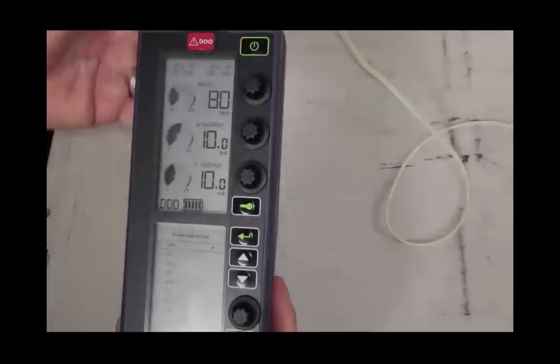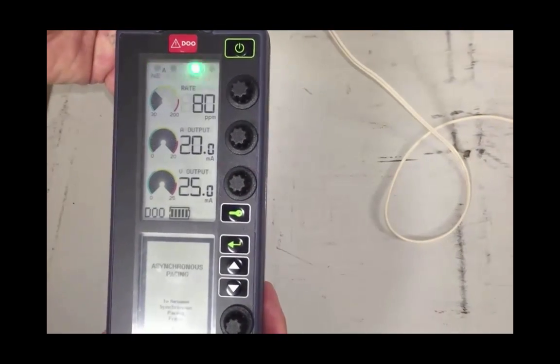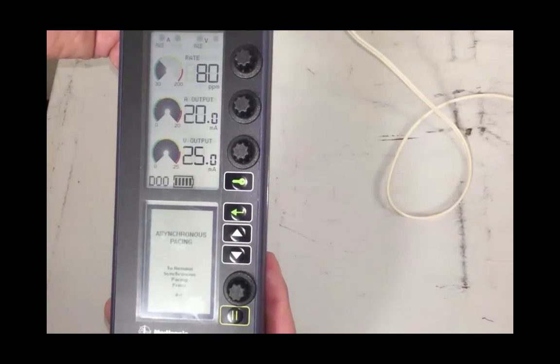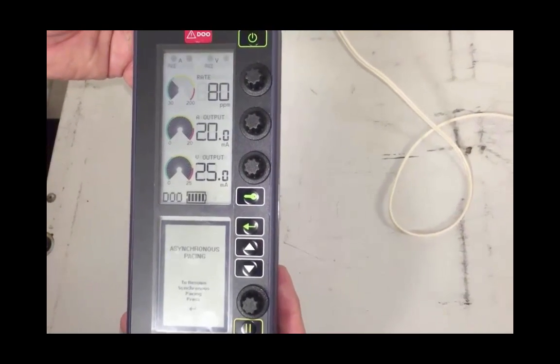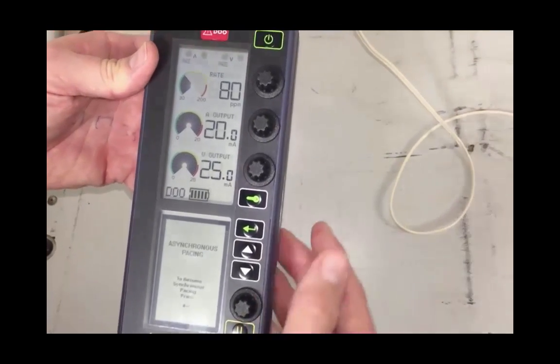In the event that you'll need to emergently pace, you'll do so in an asynchronous mode. The emergency pace button is at the top of the device, and the defaults go to 80 pulses per minute and maximum atrial and ventricular output. Again, the mode is DOO, dual chamber pacing.